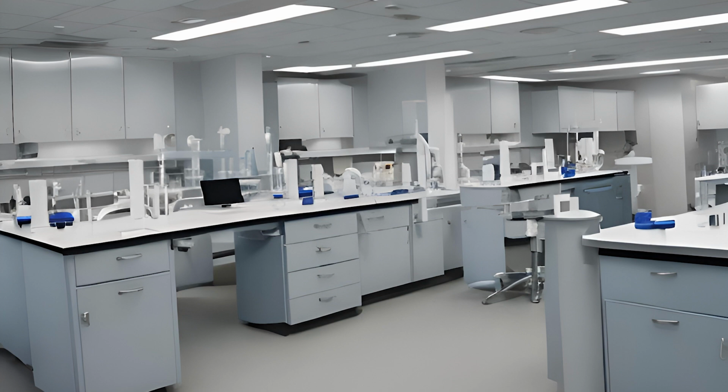OSHA regulations prohibit recapping blood collection needles after use. This is specific to phlebotomy. If you're in an operating room or some other medical environment, you may see medical staff recapping a needle. Different medical professions have different specialty standards. Don't go off on somebody because you saw them recap a needle.